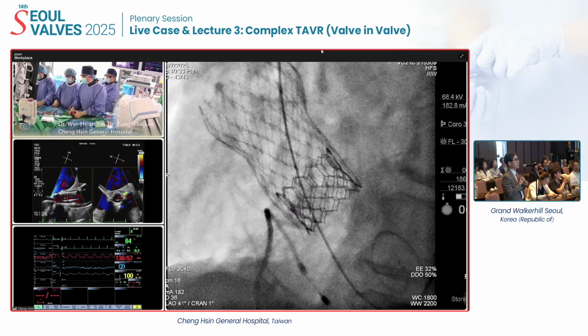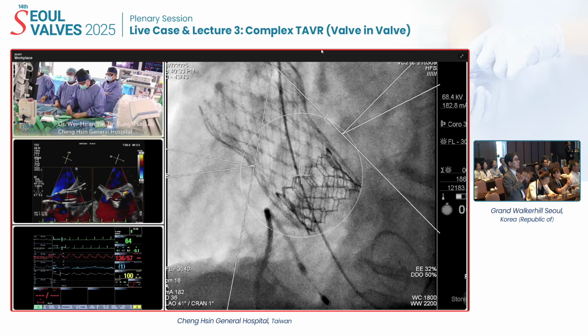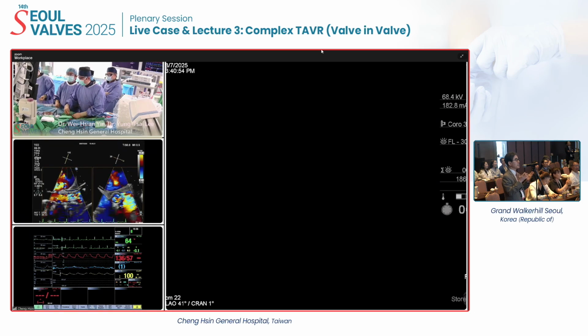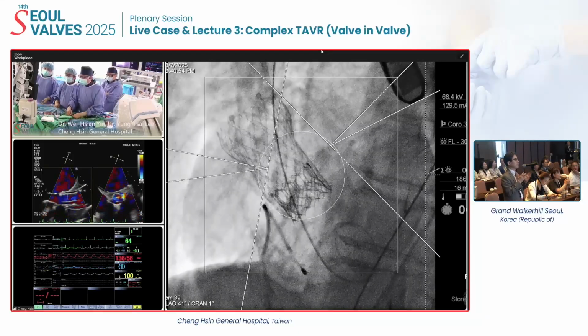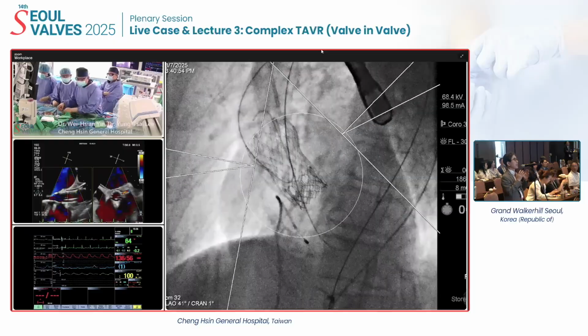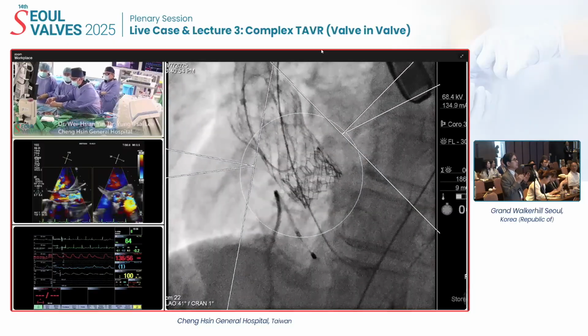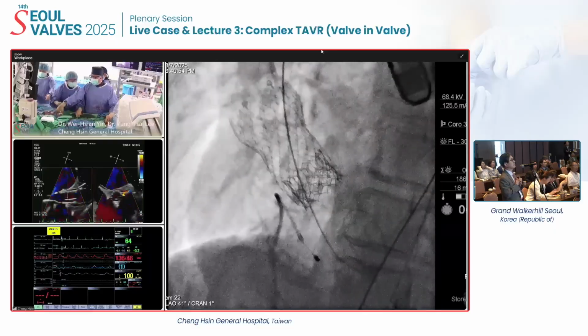Compared with traditional BASILICA with laceration, you chose this unicorn procedure because it is simpler. In your experience, how problematic is such a transient hemodynamic compromise immediately after leaflet tear with balloon? Actually, it depends on the mechanism of valve failure.